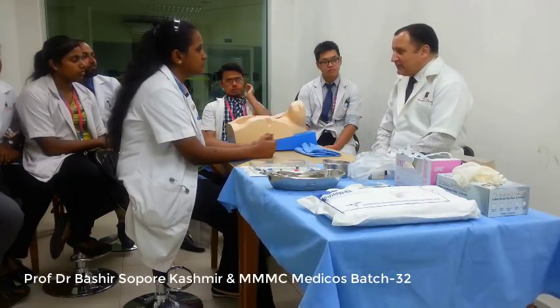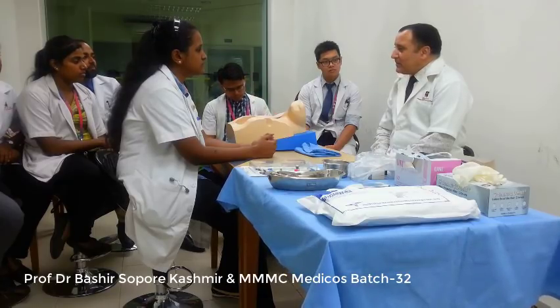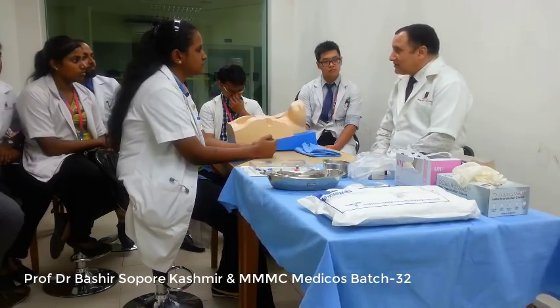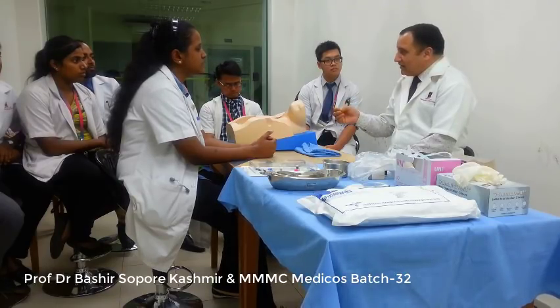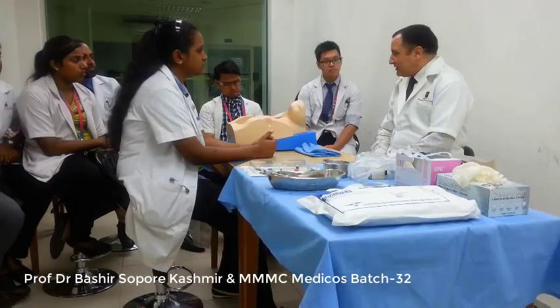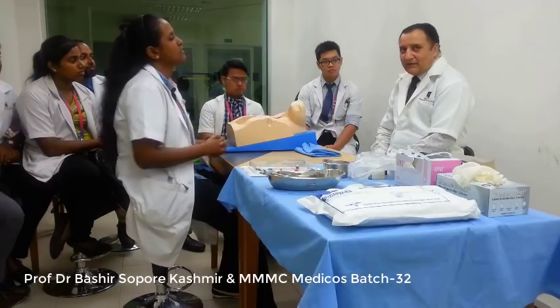The malposition of catheter is very rare in this vein, because this vein has a straight course to the superior vena cava on the right side. This vein is superficial and easily accessible, and the carotid artery is also easily identified in this area. So these are the reasons we choose the internal jugular vein for central venous catheterization.